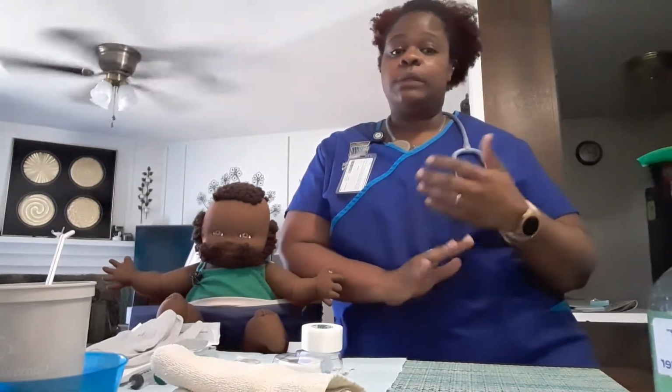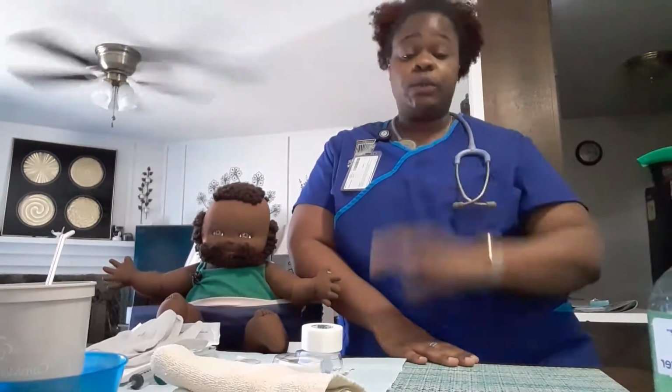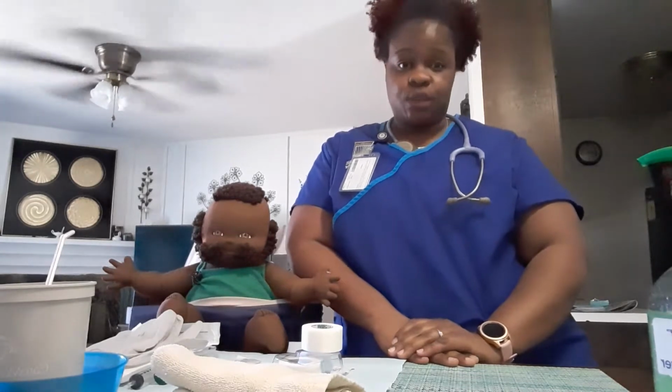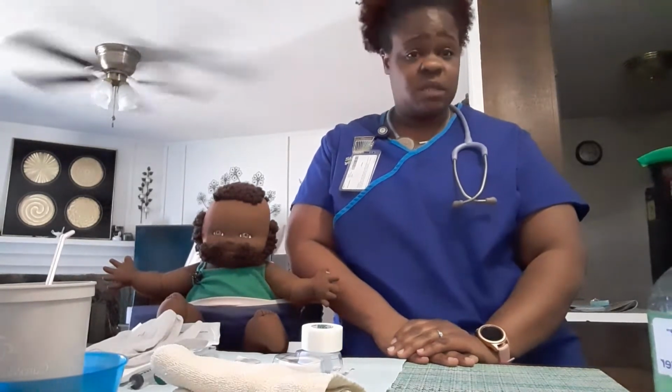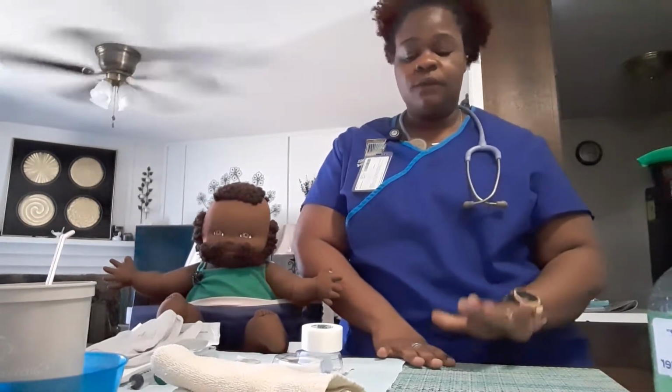And then I would tell him that it's not a pleasant procedure, it is uncomfortable, and it could obviously cause some gag issues while being inserted. And the patient still said he's fine with that. I'm going to assess him for pain, nausea, and vomiting.